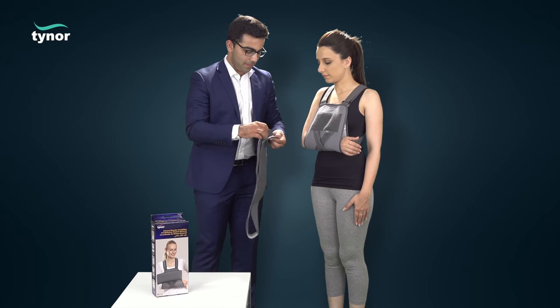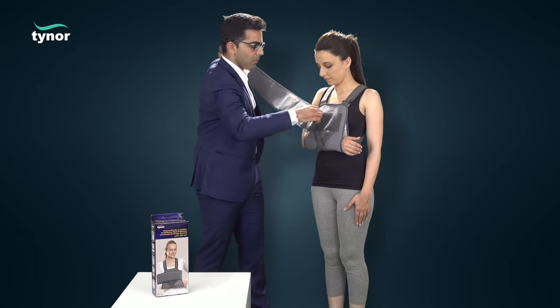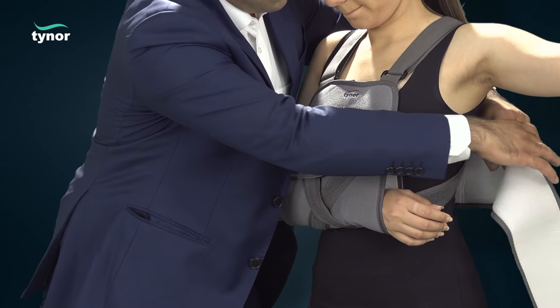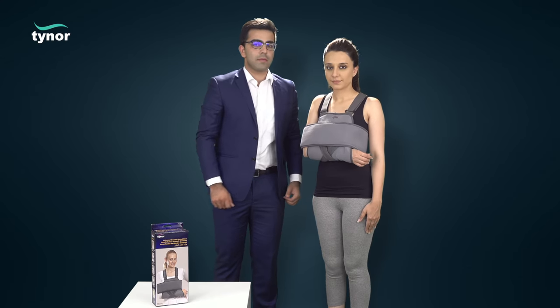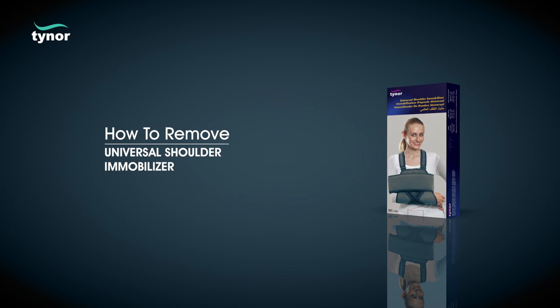The velcro stitched end of the arm restraint band is made to stick on the front side of the pouch. It is then encircled around the body with the injured arm and fastened securely so that the injured arm is tightly immobilized.